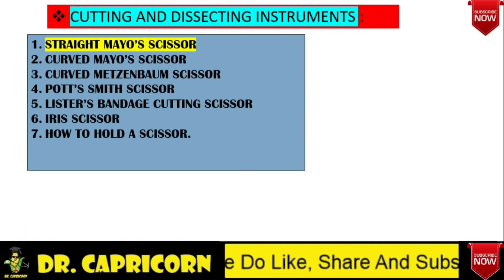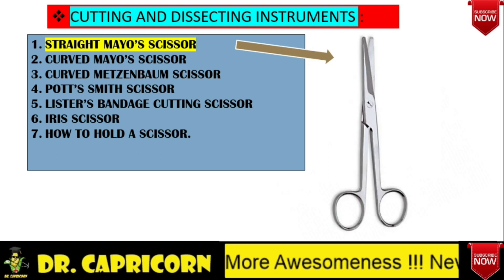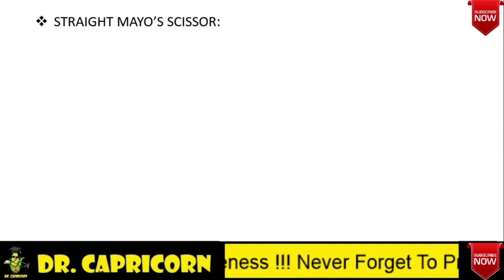Cutting and dissecting instruments. In this section, we will be learning about Mayo scissor — both straight and curved type — curved Metzenbaum scissor, Potsmith scissor, Lister's bandage cutting scissor, iris scissor, and how to hold the scissor. This is how a straight Mayo scissor looks like. Now we will be discussing about them one by one.